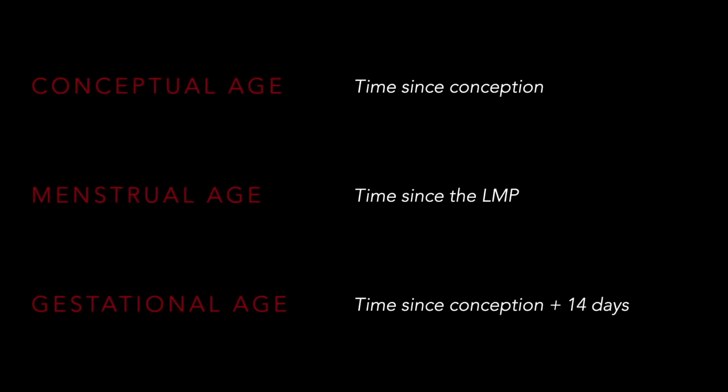Now that is to be distinguished from gestational age, which technically is rather similar, but it makes the assumption that the conception happens in the mid portion of the cycle, right? And so it tends to be less of an estimated age and more of a calculated age. And when we talk about ultrasound, this is the term that we're really going to use, right?